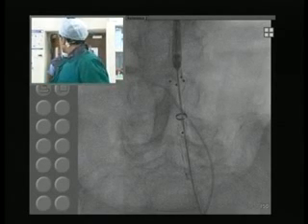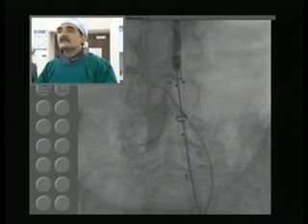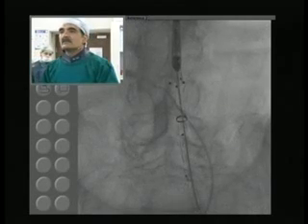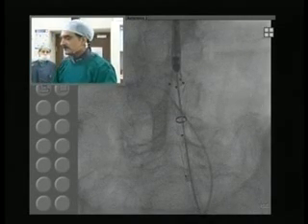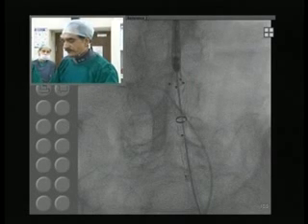Yeah, you cannulated the renal artery to know the level of the renal artery. So isn't that comfortable from the radial? Now. Okay, we'll just do one good angio just to be sure that the renal is not going to get covered.